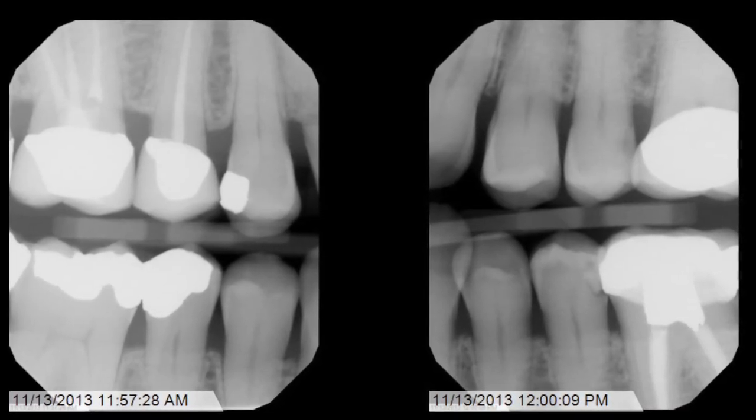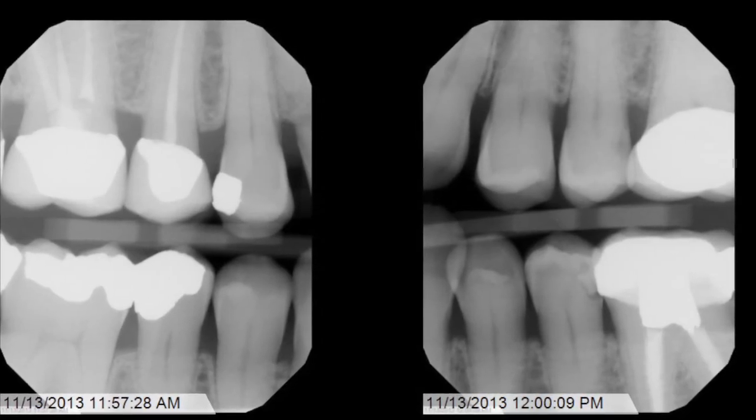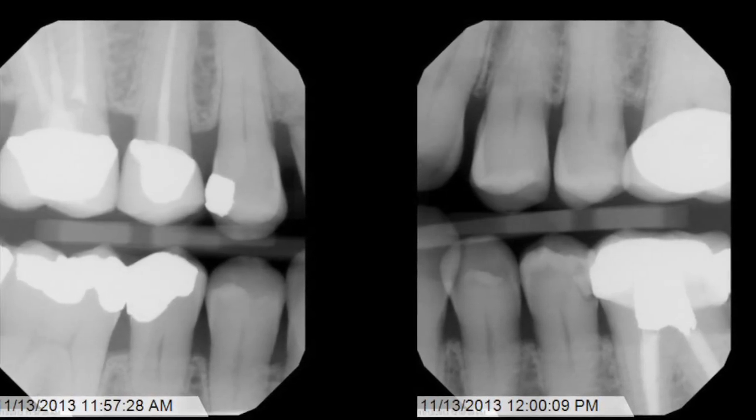You'll notice that it's not always possible to open all of the contacts at the same time due to tooth position and arch curvature. But if between the premolar and molar bite wings you can see what you need to see, you'll be covered.